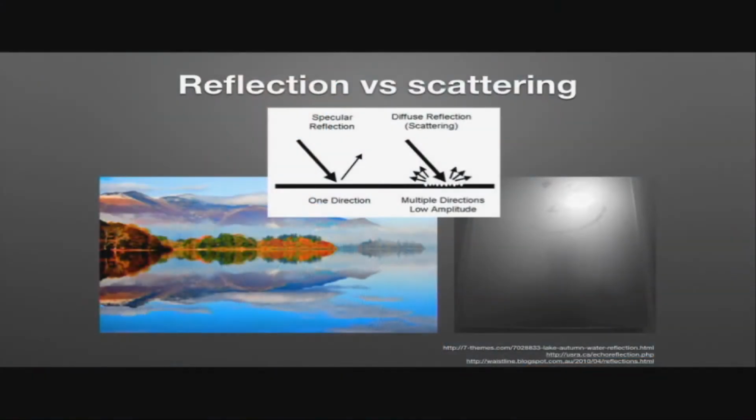that occurs. And this is where we get the idea of specular reflections, such as you can see from the example here, of a mirror image that happens off a lake, for example, versus looking at a mirror that's all misted up with water particles all over it if you're in a steamy bathroom. That gives you an example of the difference between specular reflection and scattering.